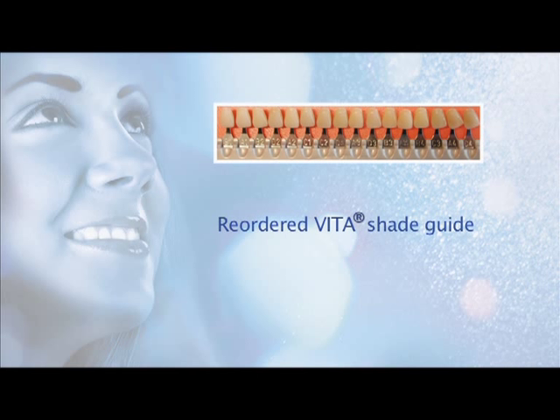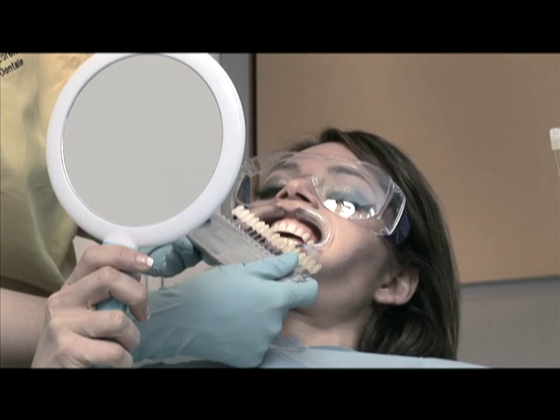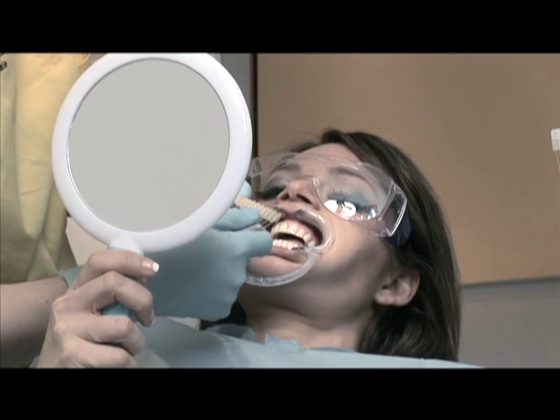Reorder the Vita shade guide according to the whitening sequence described in point A of the instructions. For whitening, the shades in the Vita guide are reordered based on shade value — that is, according to the luminosity of the tooth. In simpler terms, a colour is lighter when it has more white and darker when it has more black.